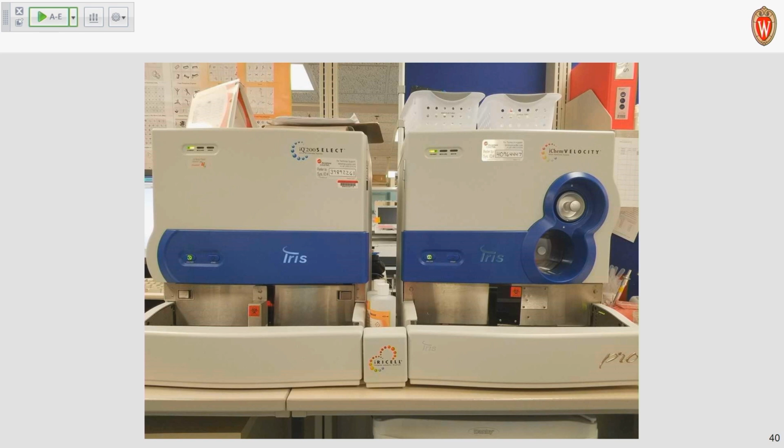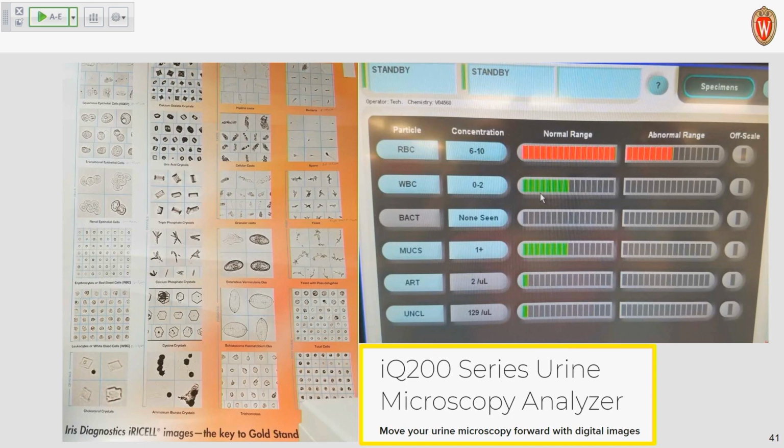Well, I wanted to put a disclaimer in. I work strictly in microbiology, and our iris is done out in the core lab. But it's just an automated instrument that does an automated UA and microscopic, so we don't do any manual microscopy for urinalysis anymore, for just our hospital, our regional medical center lab. All of the other critical access labs and clinics still do a manual microscopic. Does that picture ring a bell to you? No. Okay, we'll skip that one.